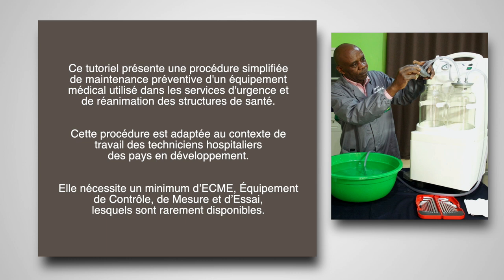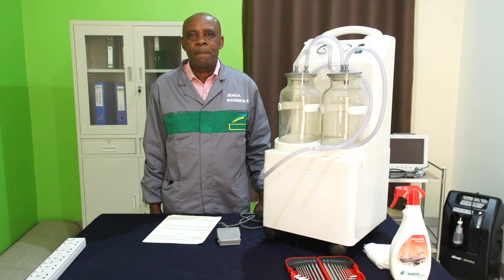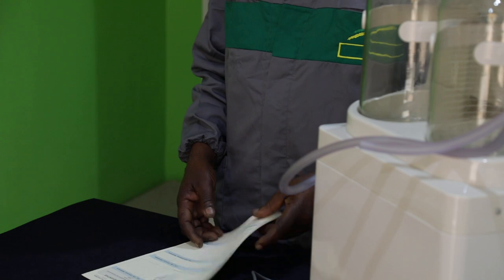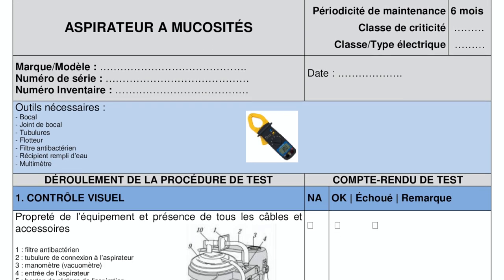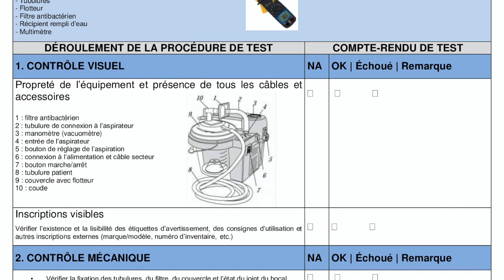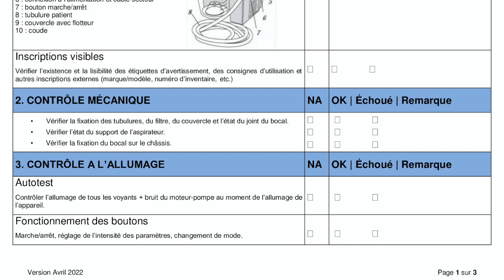Bonjour les amis, nous allons vous présenter une procédure simplifiée de maintenance préventive pour un aspirateur à mucosité. Pour réaliser la maintenance d'un appareil médical de manière générale, il faut tout d'abord consulter la documentation technique de la marque et du modèle de l'appareil. Nous recommandons de réaliser la maintenance préventive de cet appareil tous les 3 mois. Cette procédure ne nécessite pas l'utilisation d'un testeur spécifique et s'adapte à tout type d'aspirateur à mucosité. Vous pouvez la télécharger via le lien sous la vidéo.